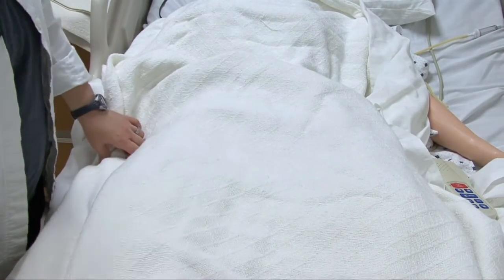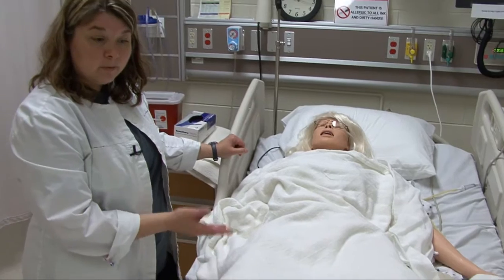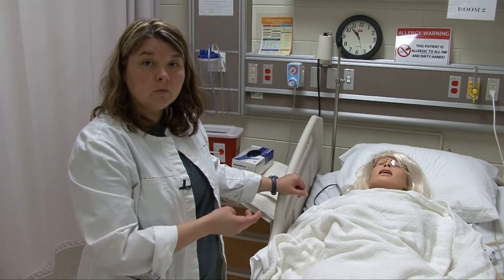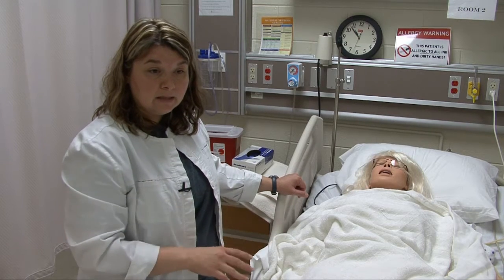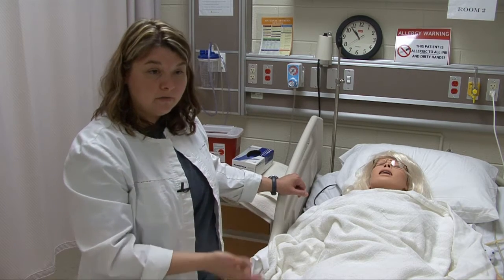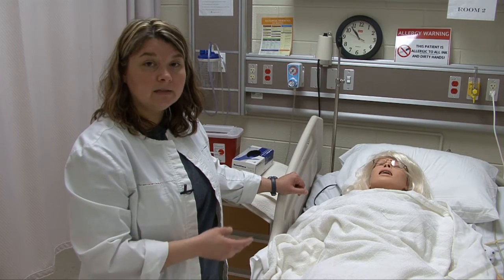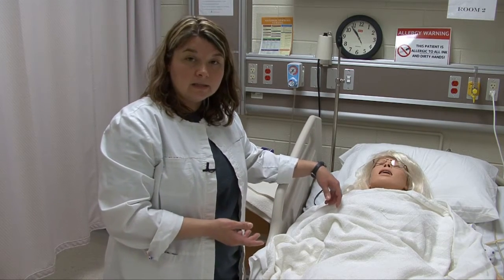I cover her up and do some teaching with Mrs. Smith. I explain that she may have some irritation after catheter removal. I need to make sure she understands I need to know when she voids again, because you're concerned about urinary retention after Foley removal. I make sure she knows there's a hat in the bathroom to collect urine so I can observe its appearance, check for odor or blood, and measure the amount. The patient should urinate within the first eight hours — if she hasn't, there may be a retention problem.